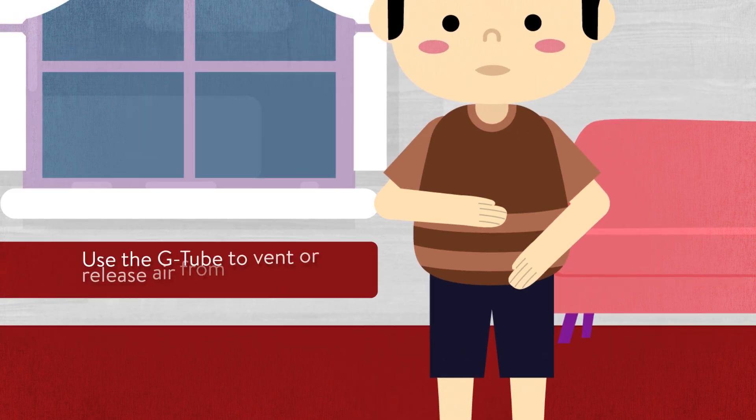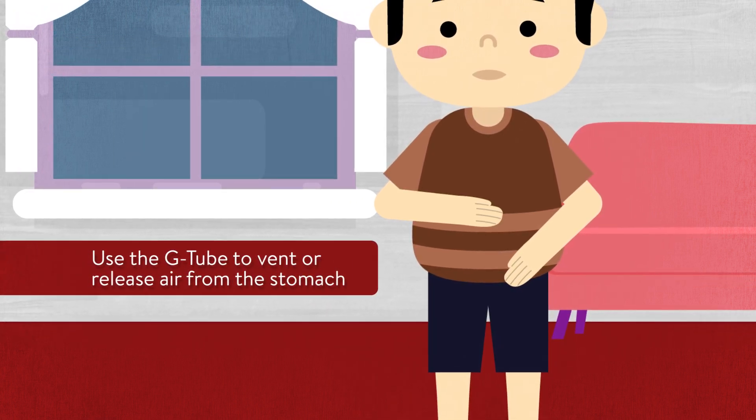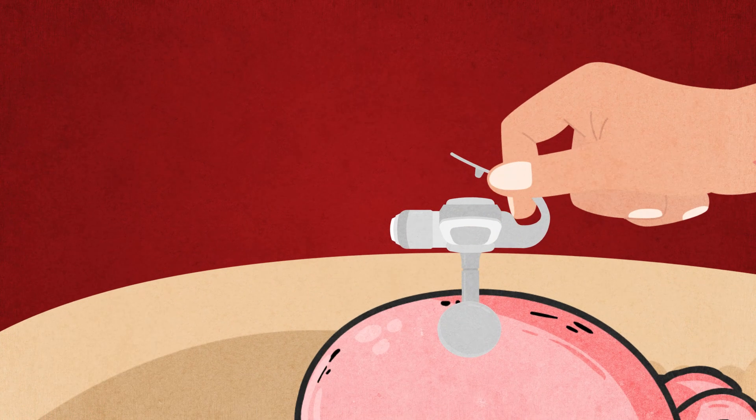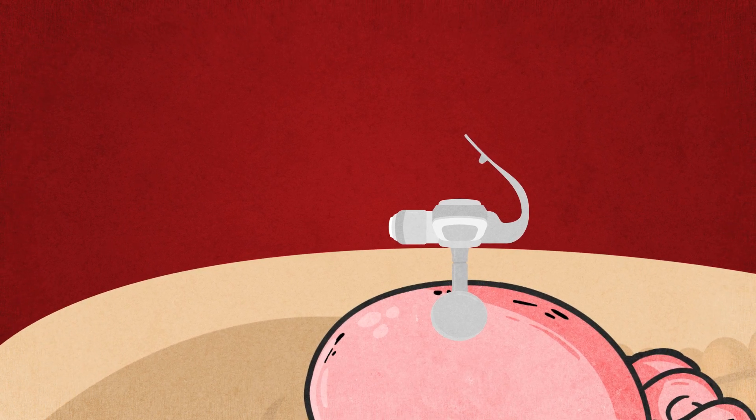You will need to use the G-tube to vent or release air from the stomach. This can be done as needed — for example, before giving formula. Just opening the port cover of the G-tube will not vent the stomach, because there is a valve that prevents air from escaping.